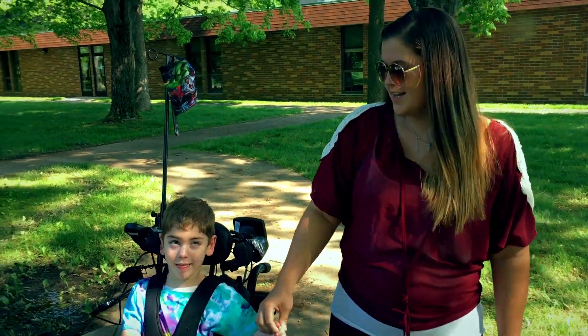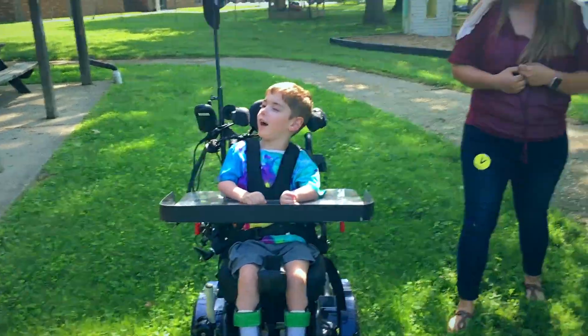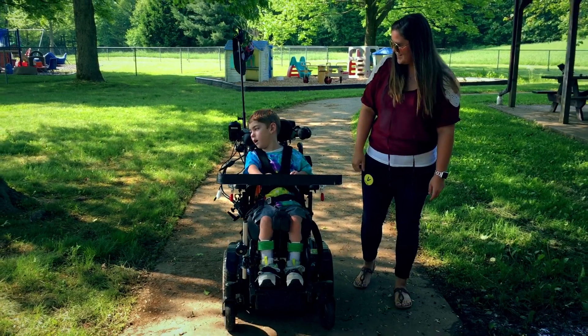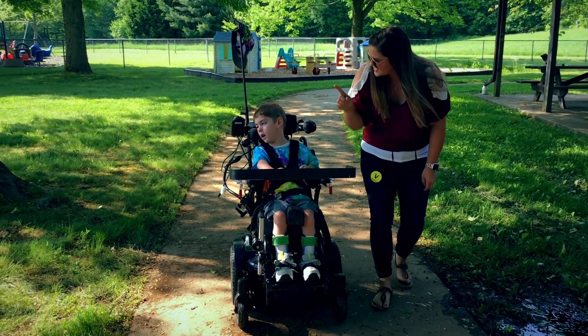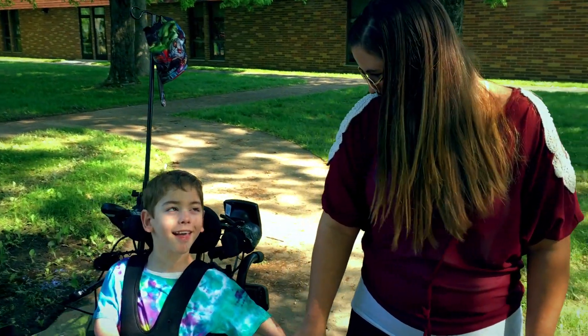He loves to go mudding and run over people and chase sissy. This gives us a lot of independence when we're out doing things as a family. We're not just focused on him — we can enjoy his sister as well, and he can go where he wants to go and look at things he wants to look at.